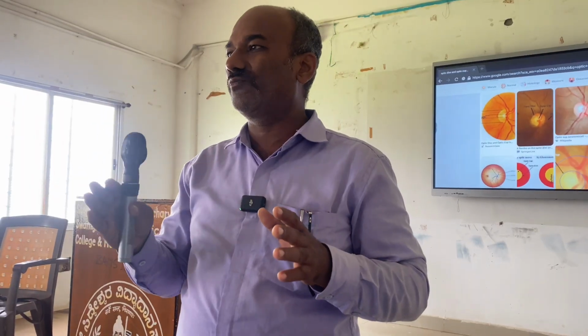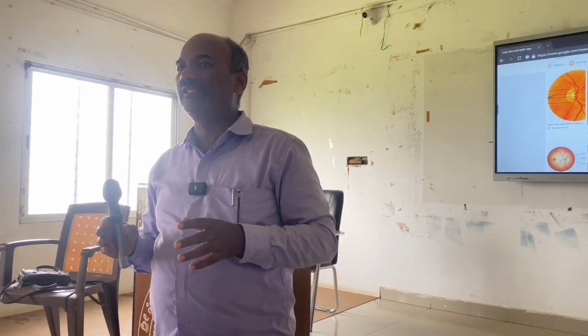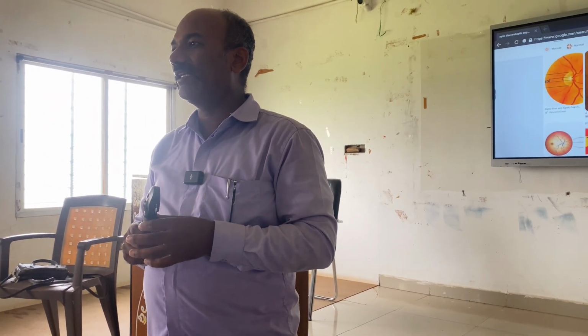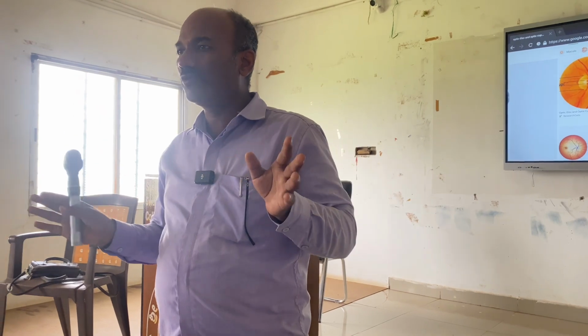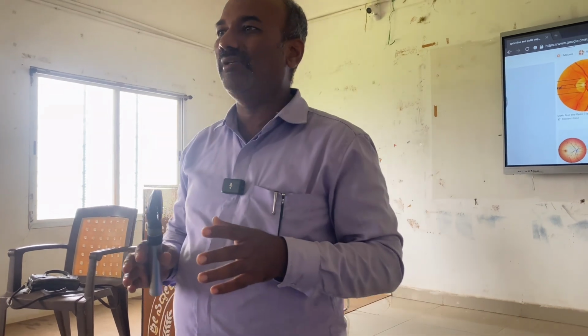How is this used for the examination? We have two types of ophthalmoscopy. One is direct distance ophthalmoscopy and the other is close ophthalmoscopy, right? In direct distance ophthalmoscopy, you have to examine the patient within an arm distance.